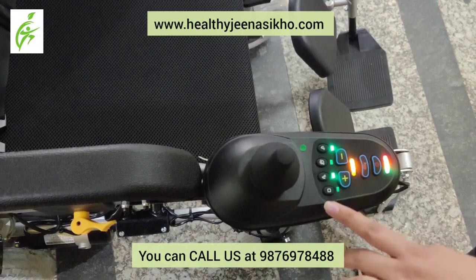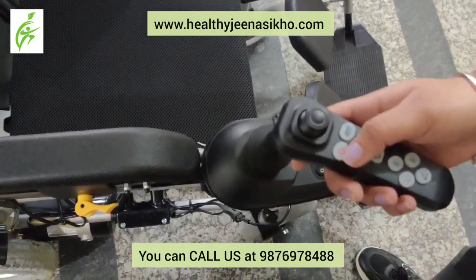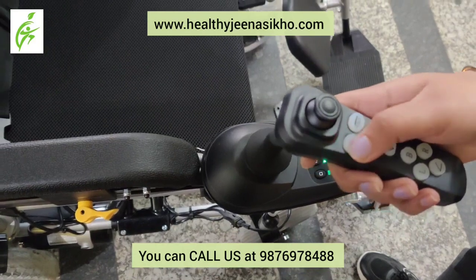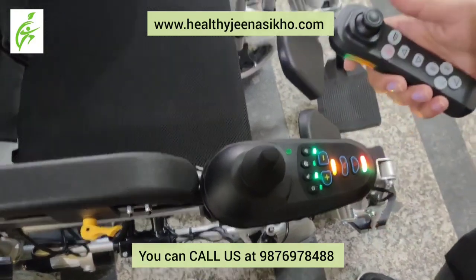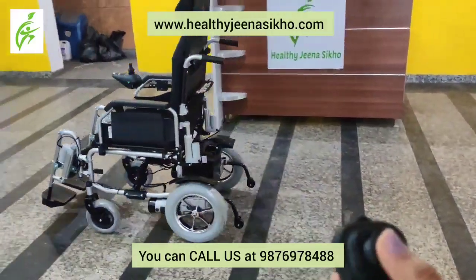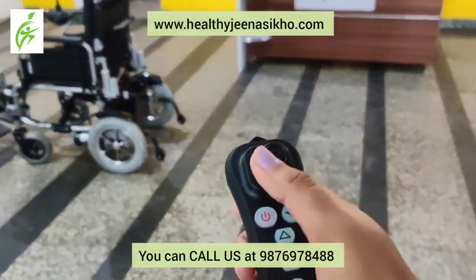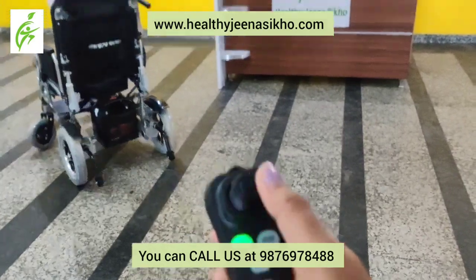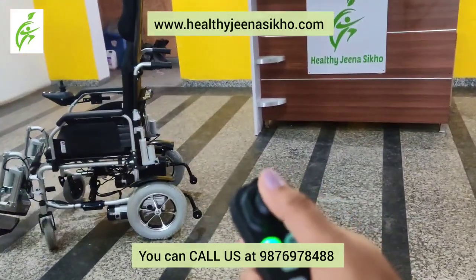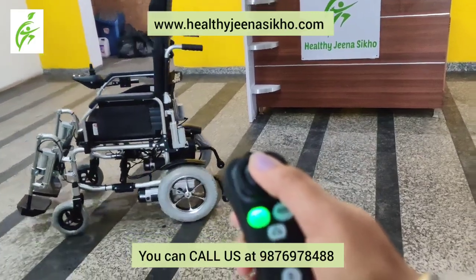How do you look at the wheelchair? How do you operate it with a remote controller? This is a new feature which now comes with new wheelchairs — it is a remote operator, an attendant controller. It can handle the wheelchair, as you can see, with the same functionality as the remote.